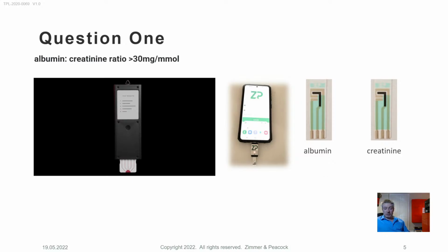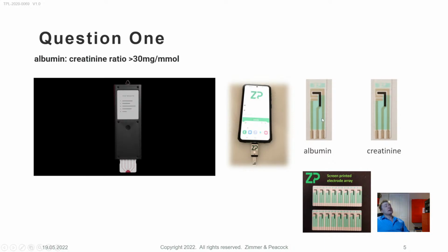These two sensors can be brought together later on, but when you're asking how to measure the ratio of these two things in the urine, I think from a project management perspective, these two sensors have to be split, or treated as little separate projects, with a scientist, let's say, on each one. It's not very hard to actually create a sensor with essentially two working electrodes.